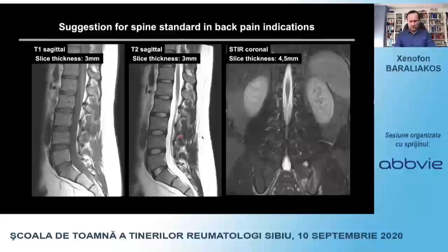But you see what you can find in such a patient. This is the same patient. There was nothing in the lumbar spine in T1 and T2. However, on STIR, we could screen and find a left sacroiliac joint inflammation. You see that on my pointer here in the sacroiliac joint. And this patient was then referred to the rheumatology department like ours to get the diagnosis of spondyloarthritis.